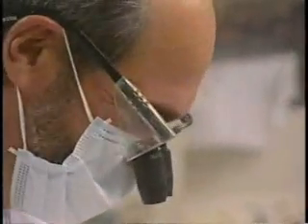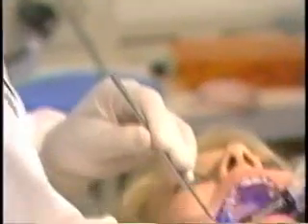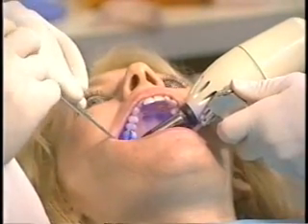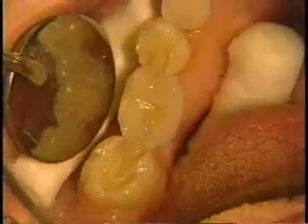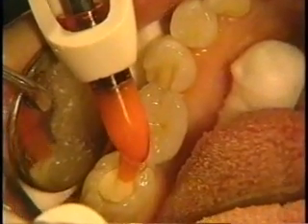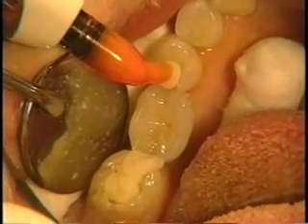After properly positioning the bridge, light cure. Completely cover the glassband attachments and incrementally fill the preparations with posterior composite resin, curing each layer with the polymerization light.